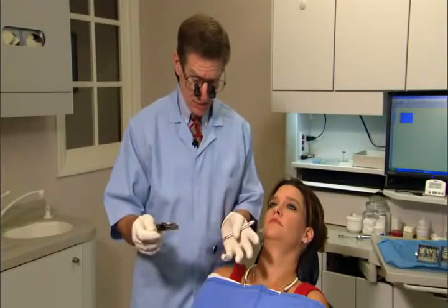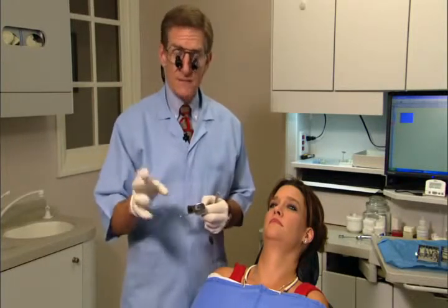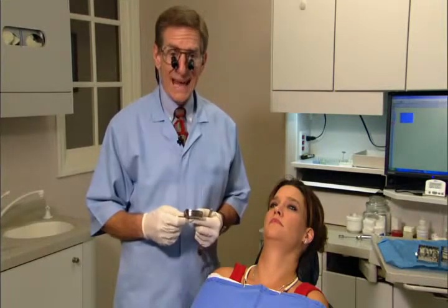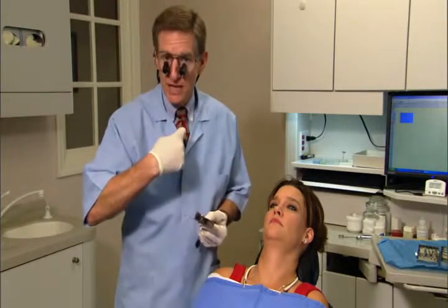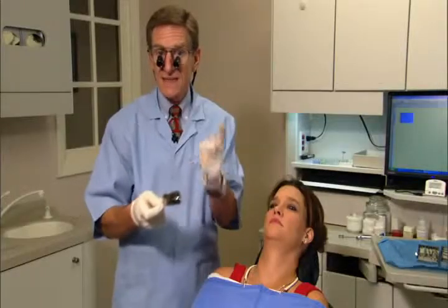Use regular set alginate — do not use fast set. Most people use fast set because of gagging, thinking that getting the impression in and out quickly prevents it. But the gag reflex is not from the throat — it's on the posterior one-third of the tongue. A rimlock tray causes excess to go out the back rather than dripping down onto the tongue, which is what causes gagging with a perforated tray.